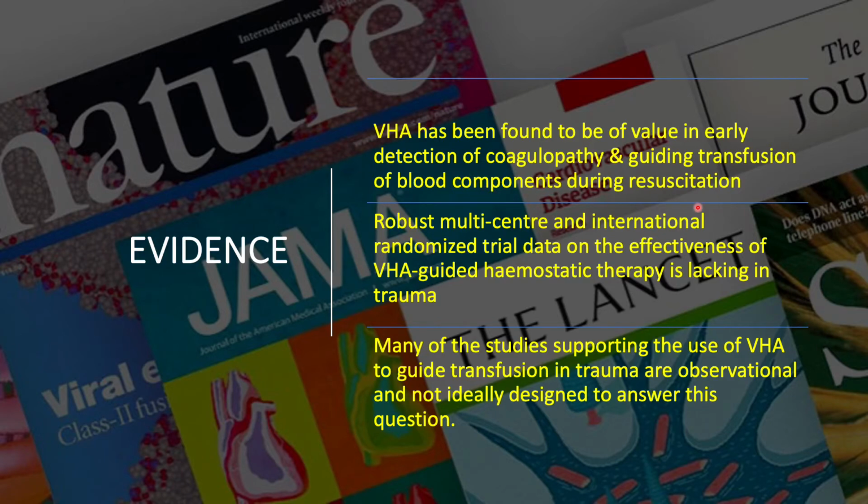There is plenty of evidence which supports the use of VHA to detect coagulopathy and guide transfusion of blood components in a bleeding patient.